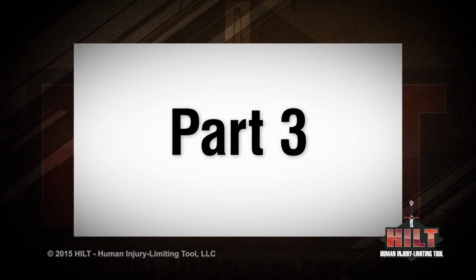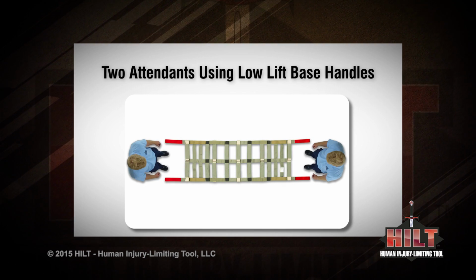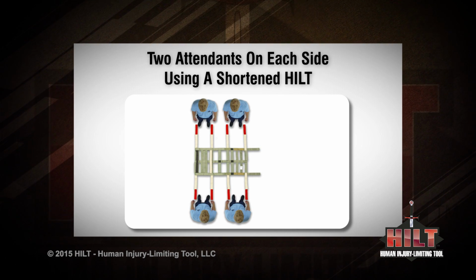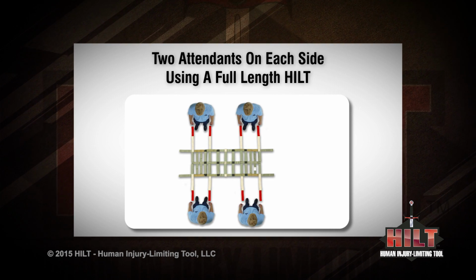Part 3. Part 3 will show some variations for attendant positions around the patient. These can be practiced in preparation for various scenarios. It is important to remember that the larger the patient is, more attendants, up to 14, can be added around the HILT.